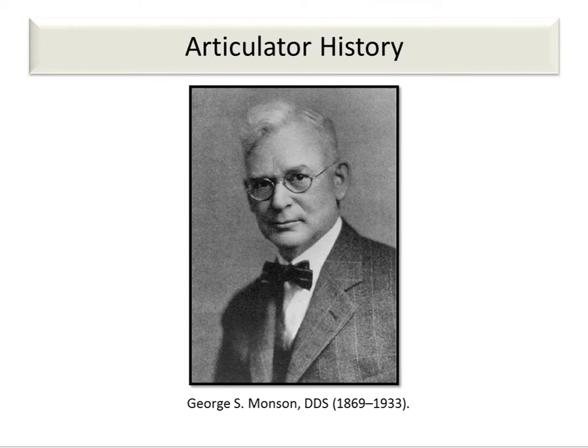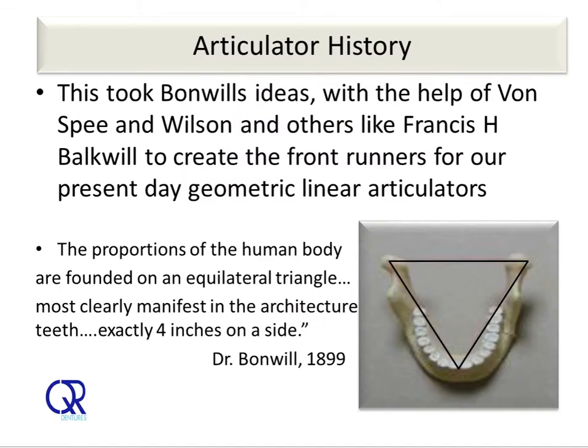The inventors most frequently associated with the geometric school of mandibular movement and articulator design are George S. Monson for his spherical theory and Rupert E. Hall for his conical theory. Today it is Monson that is recognised as founding father of our current occlusal concepts. It was earlier investigators, however, who laid the basic foundations on which the principles of the various geometric theories were built. William G. A. Bonwill and Francis H. Balkwill, who were contemporaries, although oceans apart, were perhaps the earliest investigators to apply geometric principles to articulation, mandibular movement, and the design of articulators.